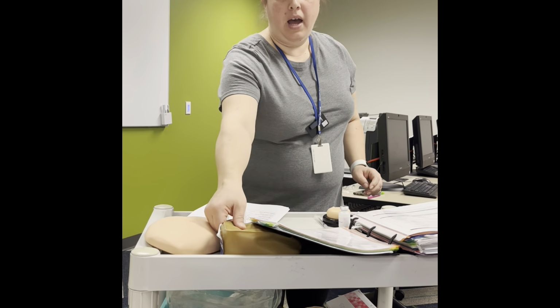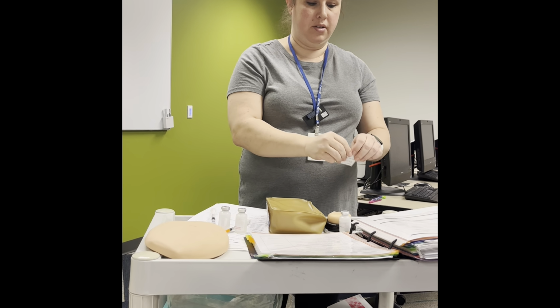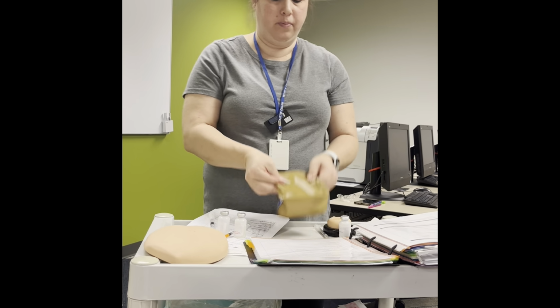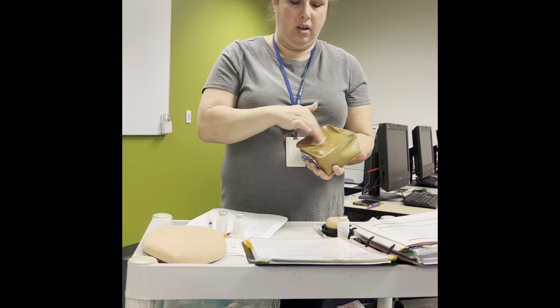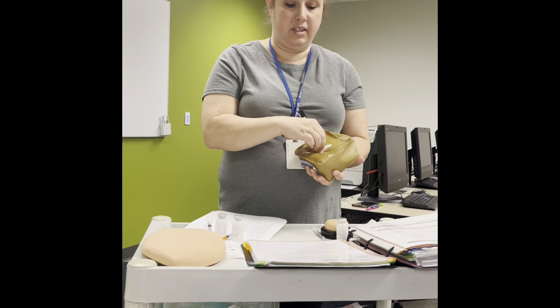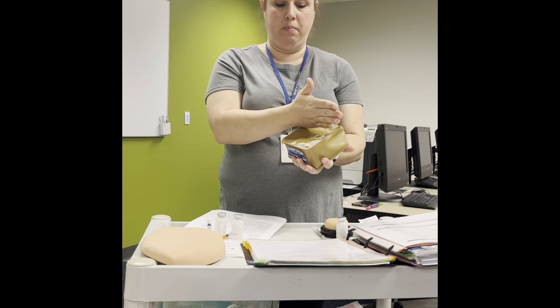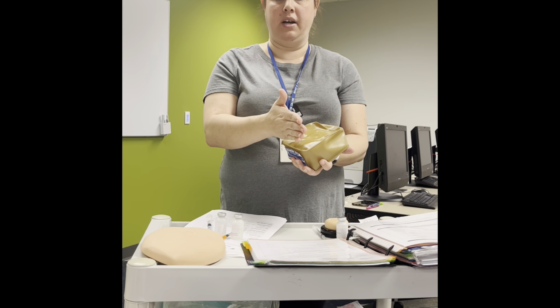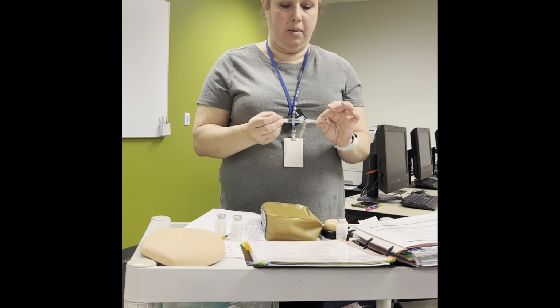Then you're gonna take the pad. We're gonna use the bigger pad this time. I'm gonna do it first. We're just gonna clean it off in our circular motion. It tells you for number 6, state how you would use the Z-track method. So I would use the Z-track method, I would push the tissue to the side to create that track. But then it tells you we're gonna uncap the needle.